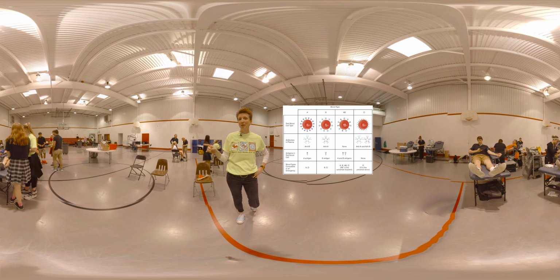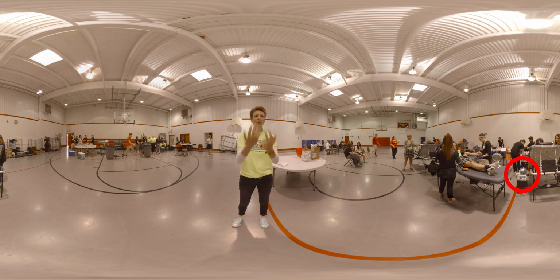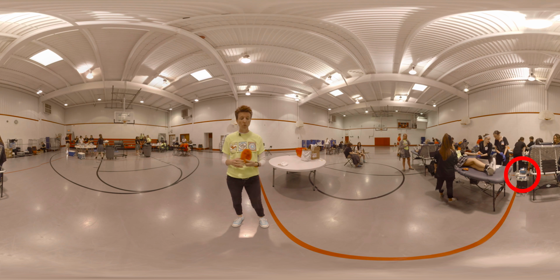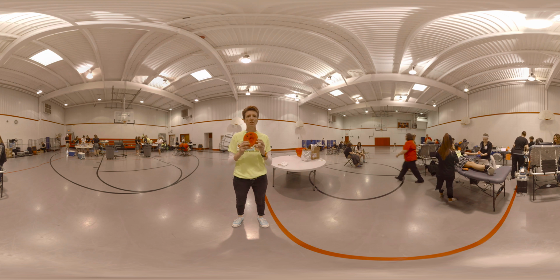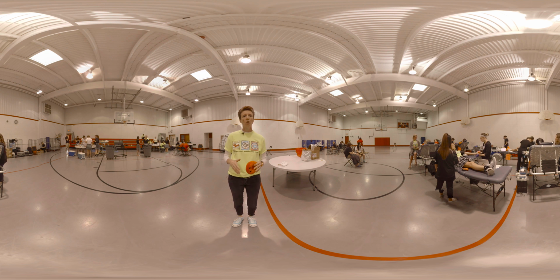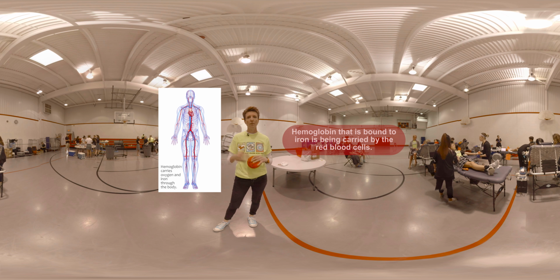Okay, so if you take a look behind you, hopefully you can see that bag of blood that's being rocked back and forth. That is a pint of blood, and that's what we consider a unit. If we were to look closely at the blood in that bag, you would notice that the most numerous component is this guy right here, a red blood cell. You have trillions of them in your body. Now, inside of a red blood cell is an extremely important protein called hemoglobin. Hemoglobin is responsible for carrying the oxygen and the iron through your body.